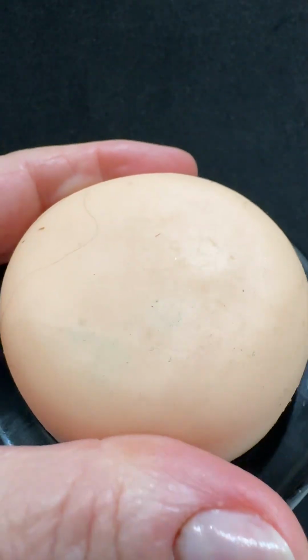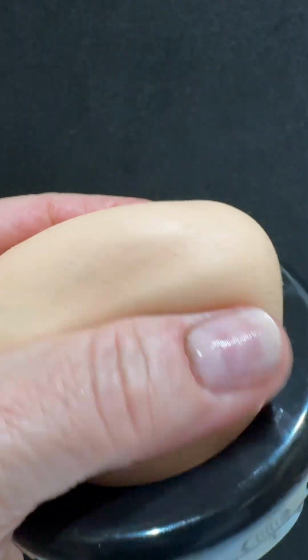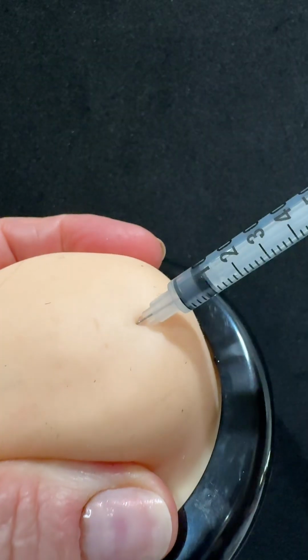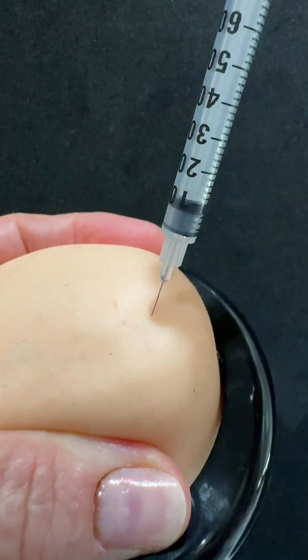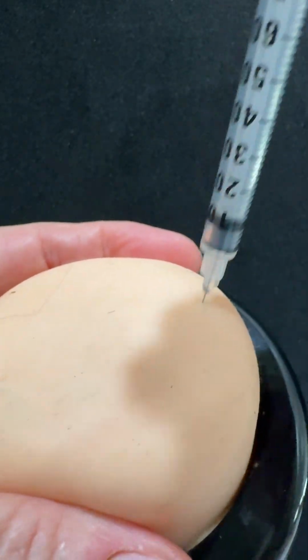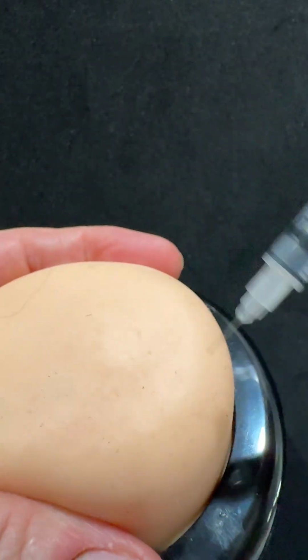When we give subcutaneous injections on our patients, we're giving it into the fatty area. So don't ever go tell your patient, I'm coming to give you an injection in your fat. They're going to be very, very upset. We tend to go at a 45-degree angle when we give the injections. If they have a lot of adipose tissue, I use the term that they're fluffy, you can go in at a 90-degree angle. So anywhere from 45 to 90 degrees.